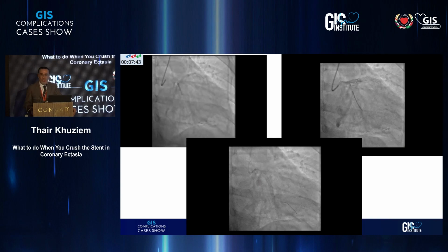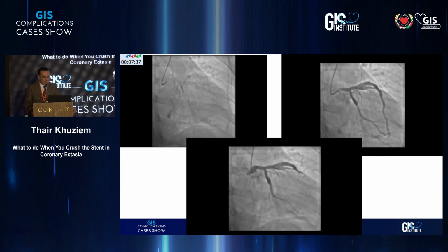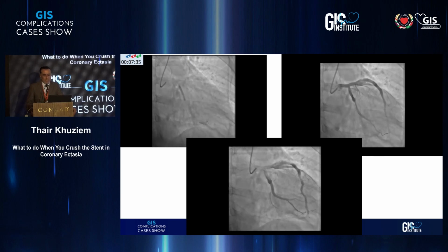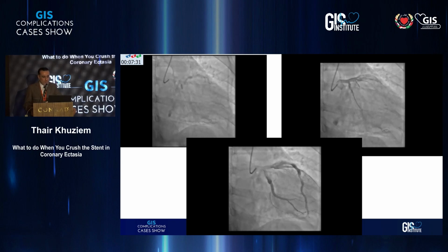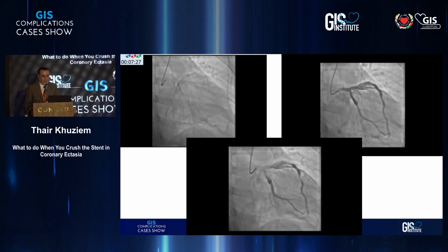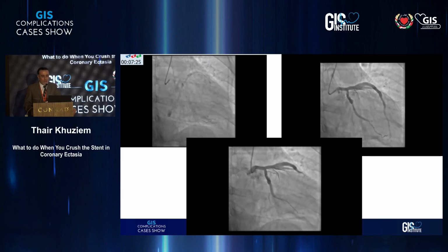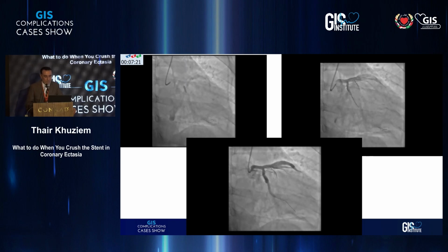So the patient having continuous chest pain during the procedure, his blood pressure started to drop, probably because of the big vessel. So we decided to dilate the lesion. Balloon was 3.0, and we decided to use a 3.5 drug-eluting stent. And actually, I put the stent to cover even the ectatic area or the aneurysmal area.